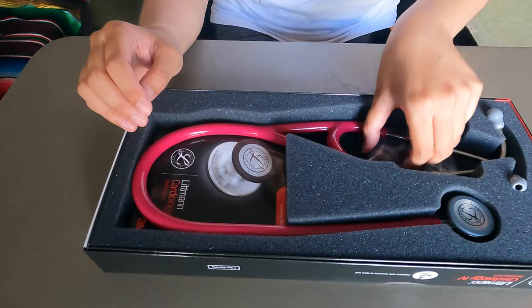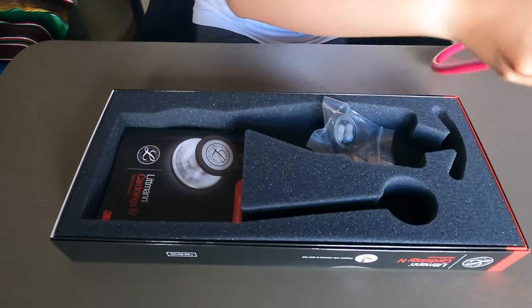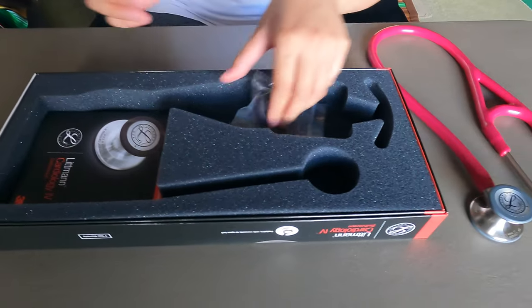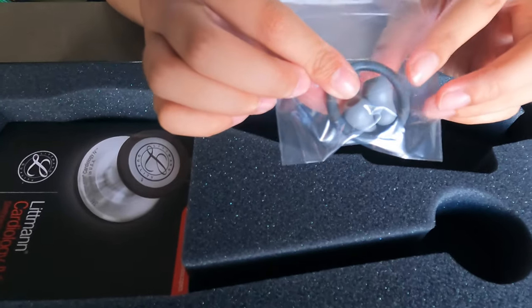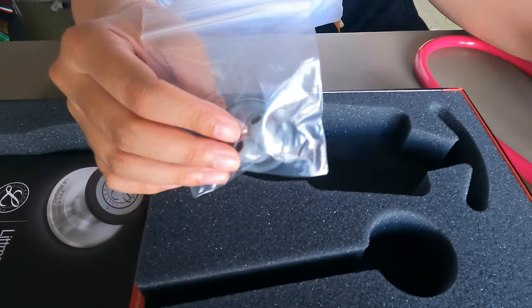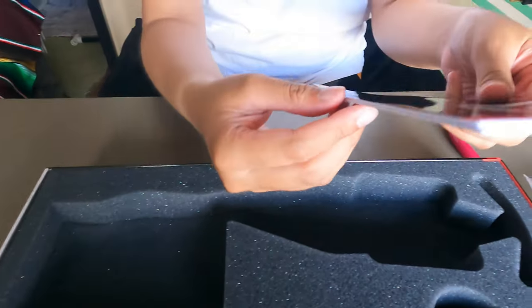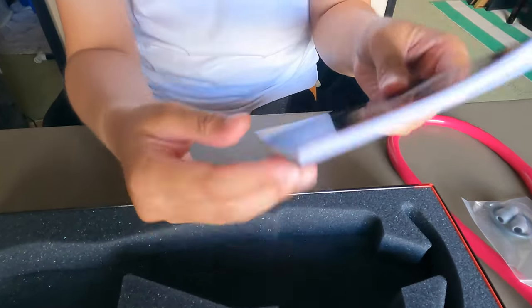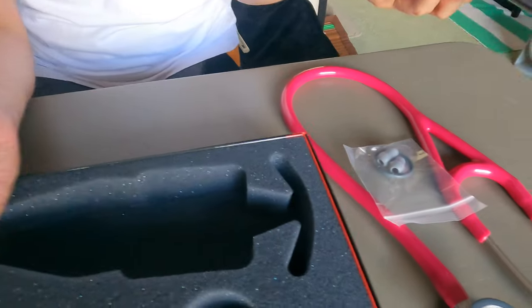Beside the stethoscope, let me carefully take it out — it also comes with some extra ear cushions, which is great in case the original ones wear out or get too dirty. It also comes with documentation, probably a warranty and instructions on how to use and clean your stethoscope properly. That's everything that came in my stethoscope box.